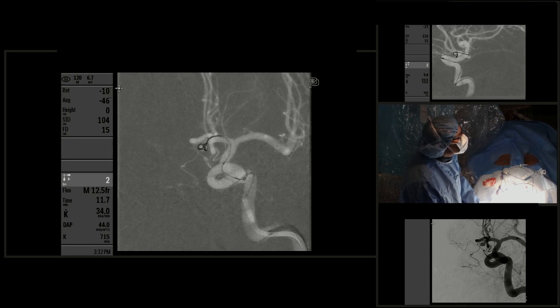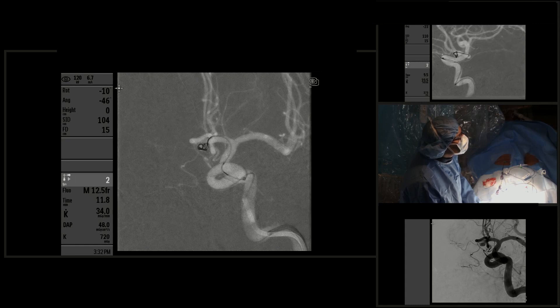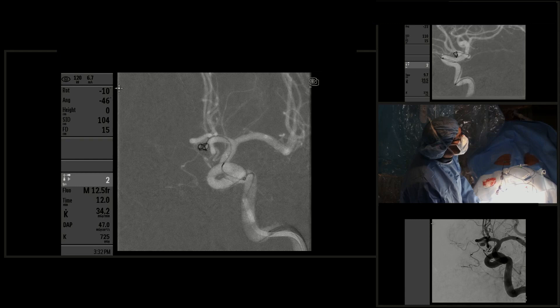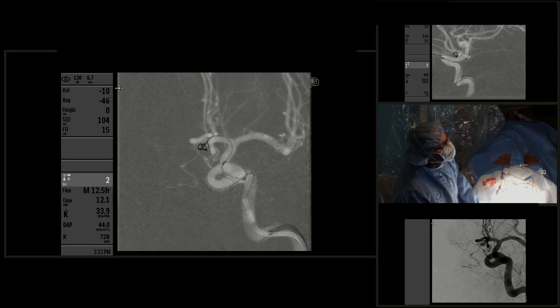The microcatheter is very stable. Advancing the guide catheter and using a triaxial system together with the distal access catheter made a big difference for support of the microcatheter. After advancing that first coil, we performed an angiogram to verify the position of that first framing coil.